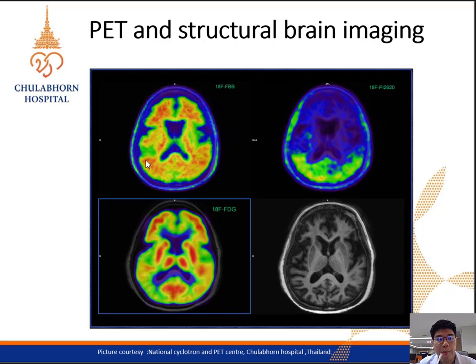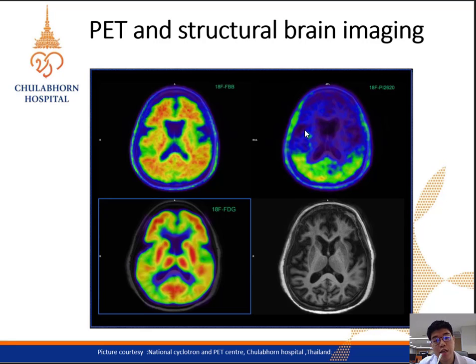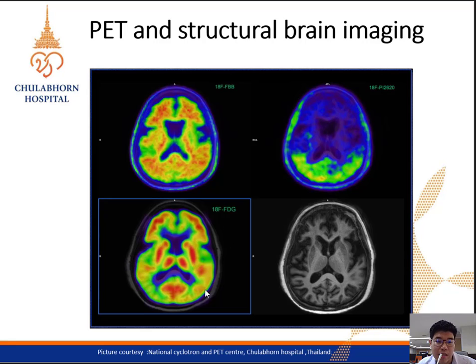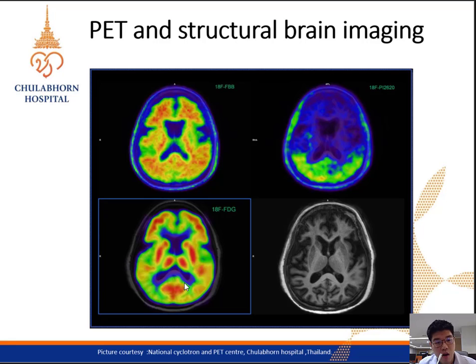The PET images shown here: after acquisition, pathologic areas with high tau or amyloid deposition will be highlighted. This image shows amyloid beta deposition using florbetaben or flutemetamol, this is tau deposition detected using PI2620, and this is brain metabolism using FDG. You may see that the tau protein deposition at the occipital area correlates to hypometabolism on FDG and also to amyloid beta deposition in the occipital area.